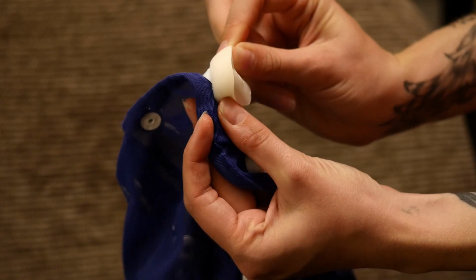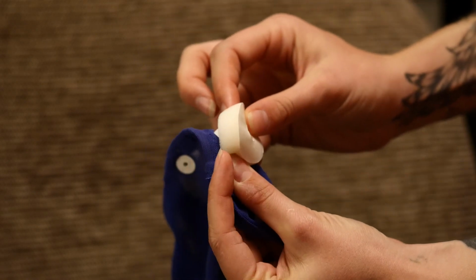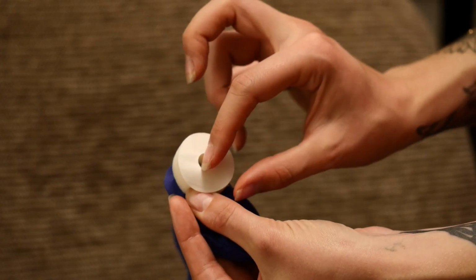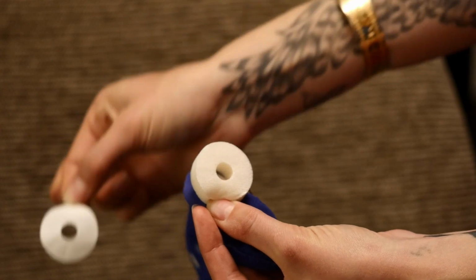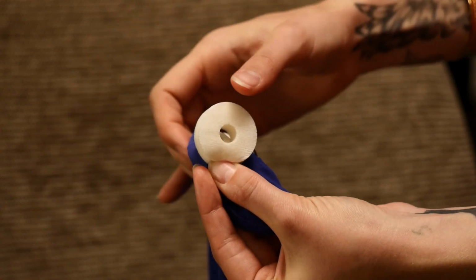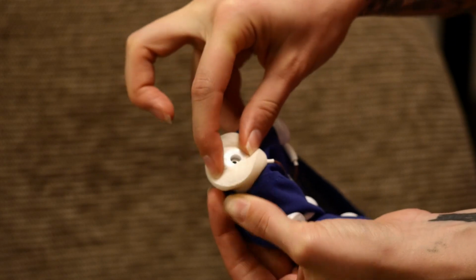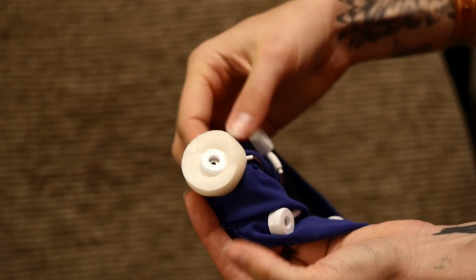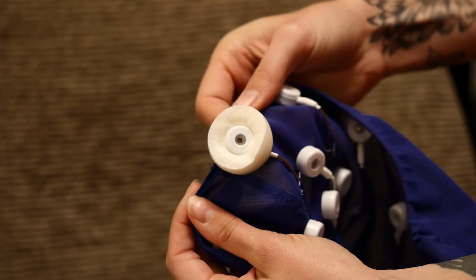And now when we have that firmly in place, grasp firmly on the edge of the electrode, we are going to remove the paper covering, exposing the adhesive beneath. While we're still holding that in place, our other hand is going to flatten it around the outside of the electrode, keeping it firmly in place. And now, once we put our second one in, we are ready to put those onto our forehead and cap.